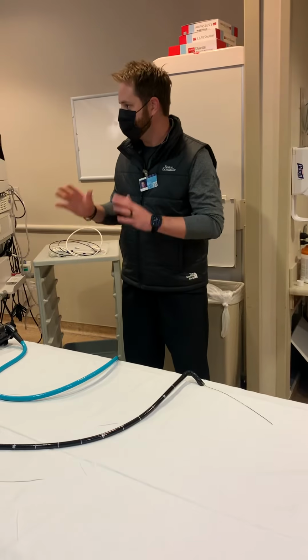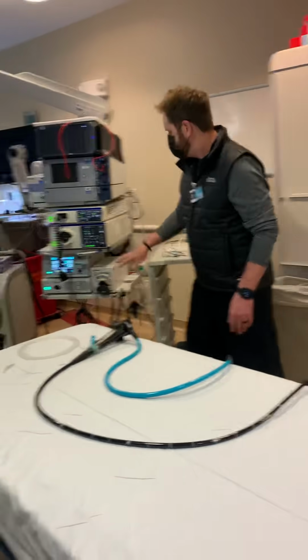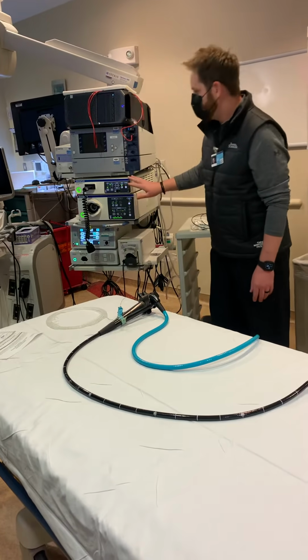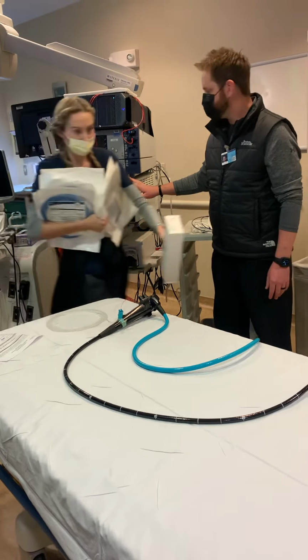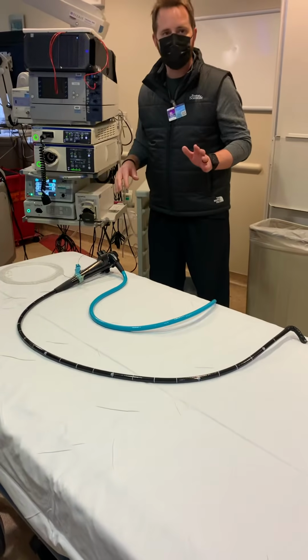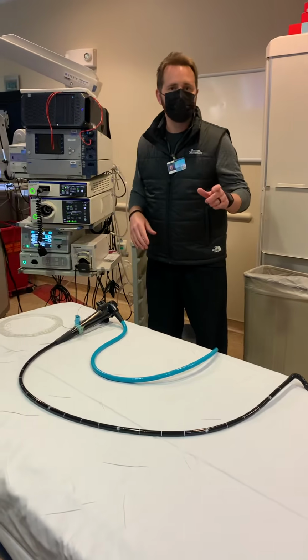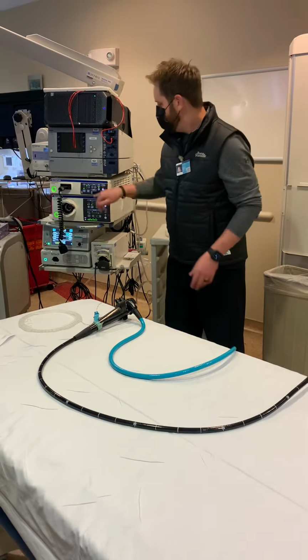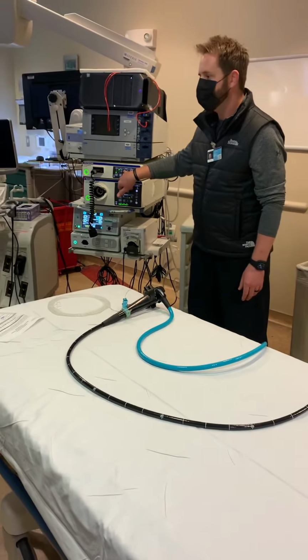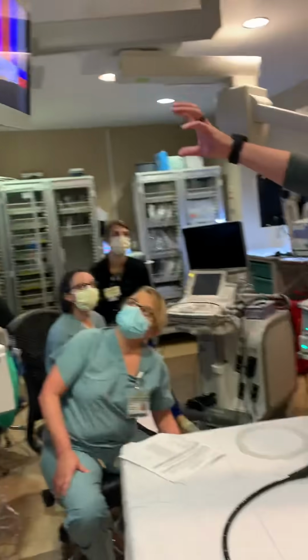Question, one person's job at the beginning of Spyglass. So Spyglass communicates directly with your Olympus processor. You guys already know this, but I'm just going to run through it one more time. Olympus, just like your TV at home, has a function on it that's picture-in-picture. If you hit custom 1 on the Olympus processor, on your monitor, you'll get a screen within a screen.